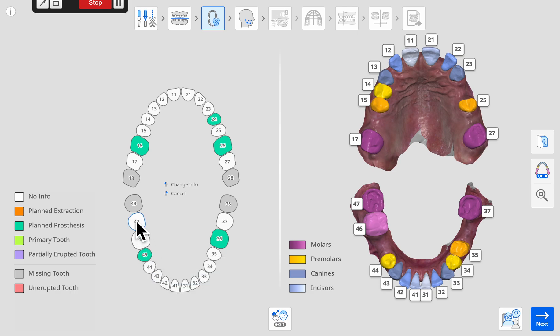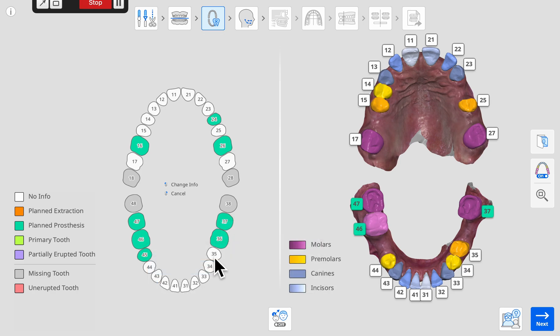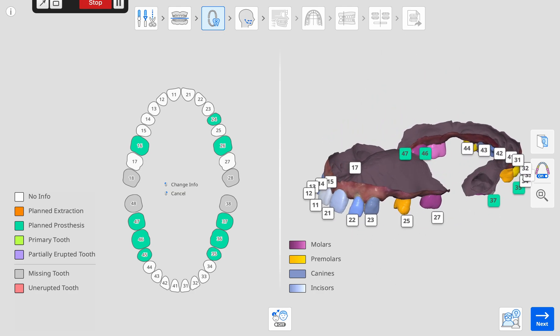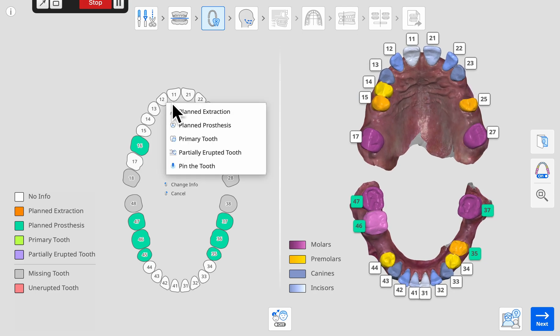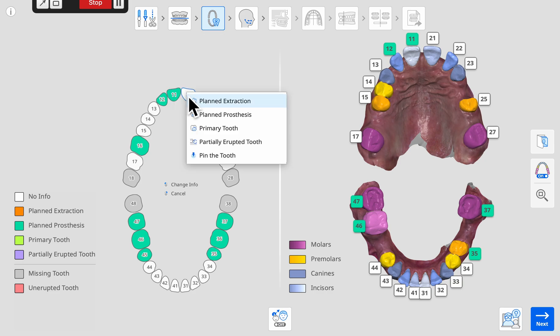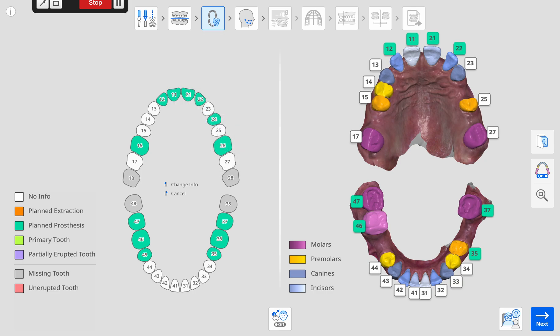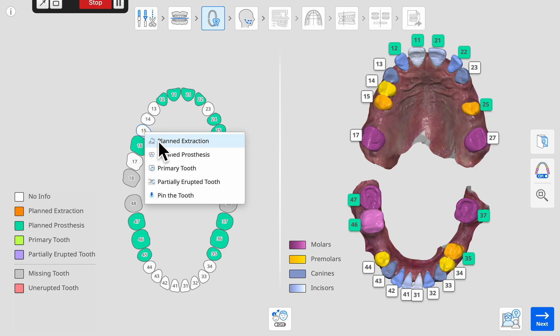We can also select the planned prosthesis option for existing teeth that are severely worn or poorly restored, such as the lower molars in this case example. If the anterior teeth are also in poor repair, select planned prosthesis for them as well to consider cosmetic restorations for the best aesthetic outcome, such as the upper incisors in this case. It will be helpful to know how we plan to manage all the spaces in this case example.